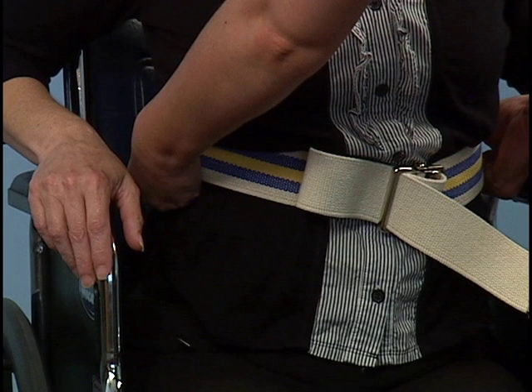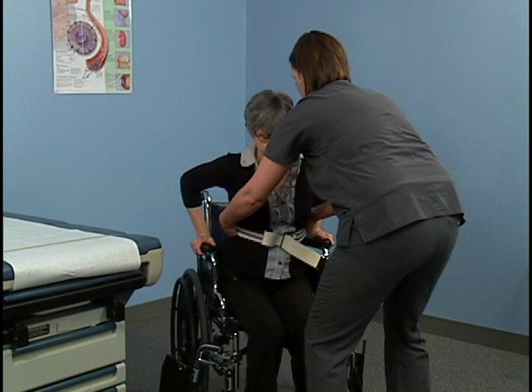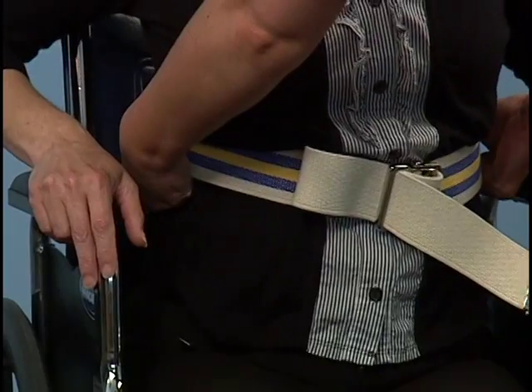Grasp the transfer belt on each side of the patient's waist using an underhand grasp. The transfer belt provides a secure handle for holding onto the patient and controlling the patient's movements. Tighten your abdominal and gluteal muscles in preparation for the transfer. Instruct the patient to push off the armrests and into a standing position on the count of 3.